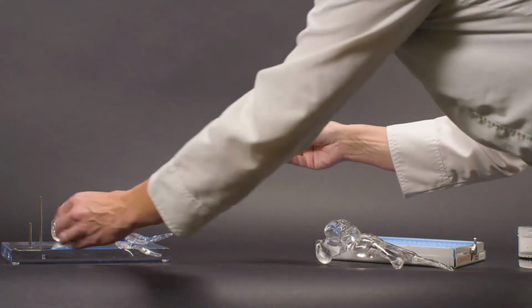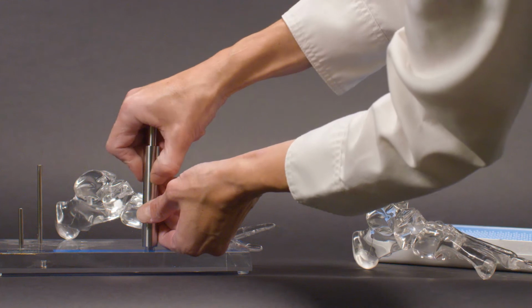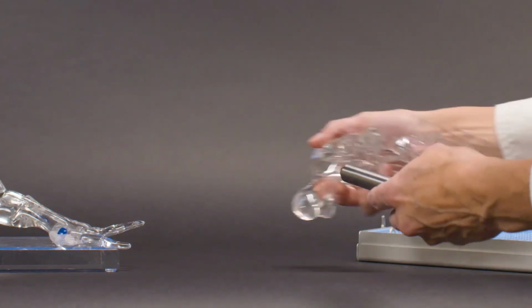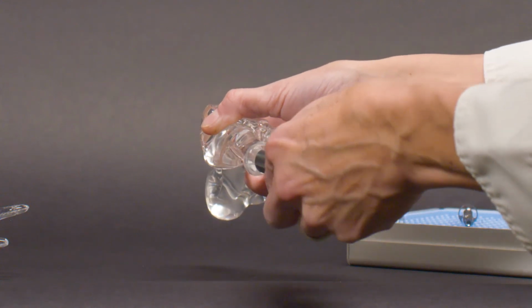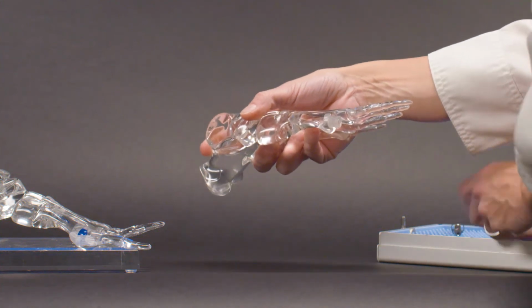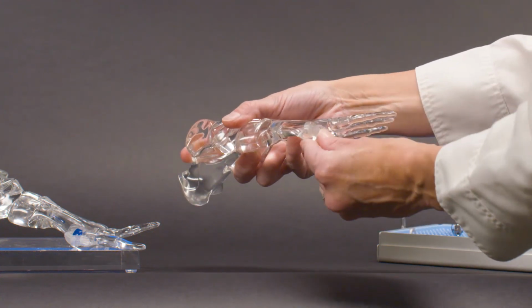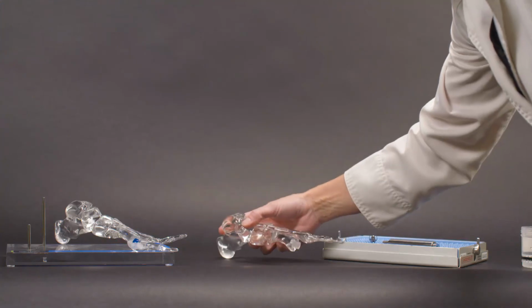In surgery, we actually impact it all the way down to the very end on the back table where the surgical technician is. You can almost see it in there. Then, with the assistant holding the foot, you put it up to the foot and impact it into the foot. I'm going to leave it sticking out a little bit more than we do in surgery. We go about half more, so there's really only about 3 or 4 millimeters, but you can see it ends up being a very effective bumper and replaces the cartilage and takes away pain, but yet allows motion.